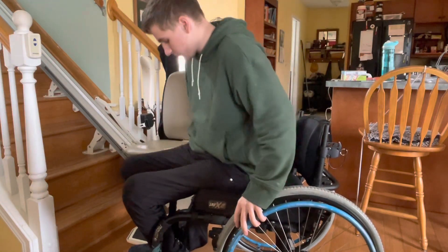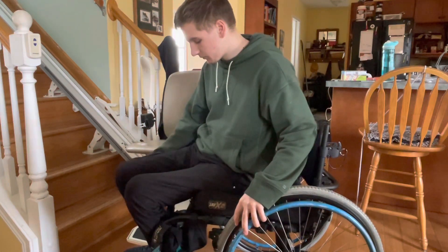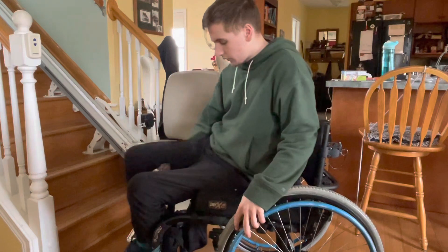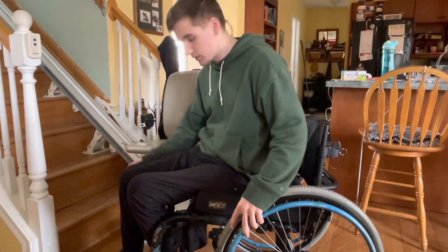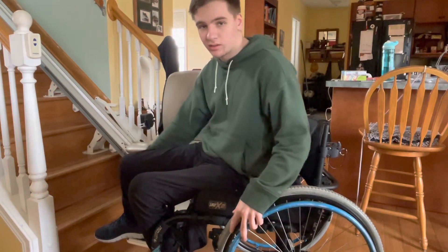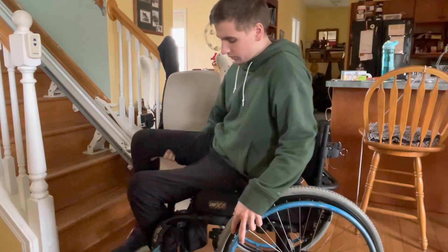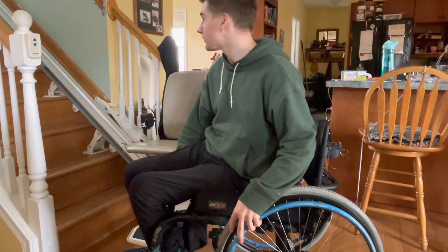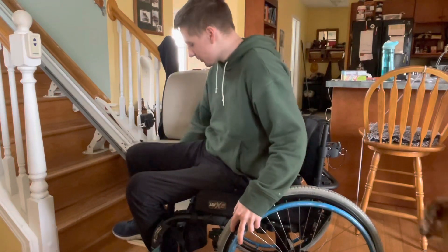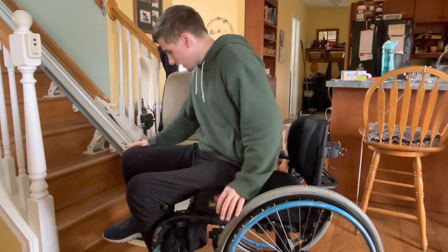First things first, I'm going to get to this corner of the chair so I'm as close as I can get without actually having to transfer yet. Then I'm going to put my foot off of my foot plate — at least the front foot — so it doesn't get caught and bent the wrong way. I put my foot off the foot plate and then I put one hand on the place I'm transferring to.